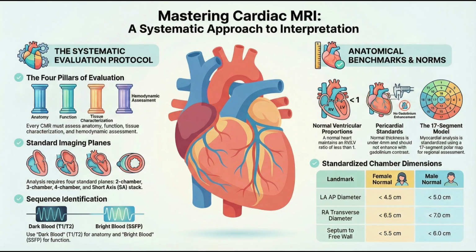So, pulling this all together, Dr. Munib's guide really suggests that the complexity of cardiac MRI, that final boss feeling, is actually manageable if you just stick to the workflow. It's a discipline. You don't just look at pictures.